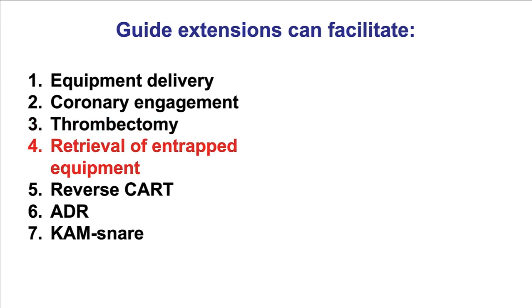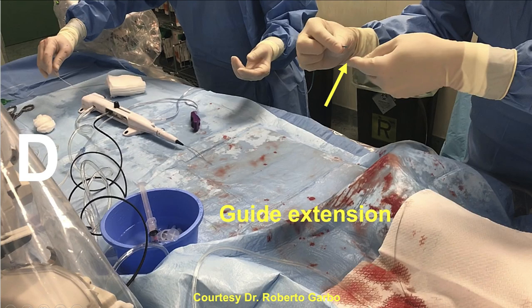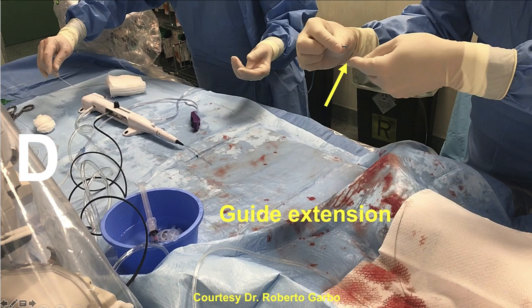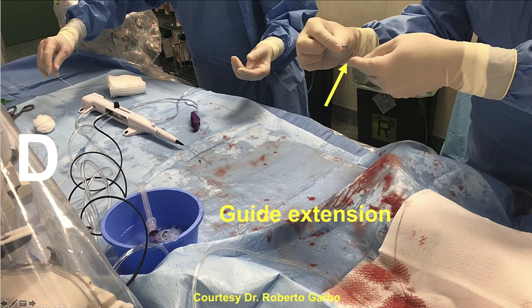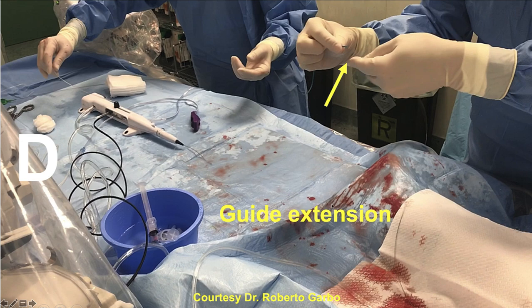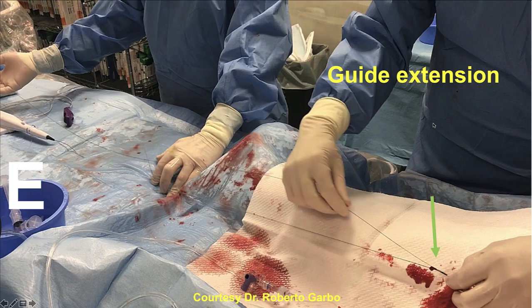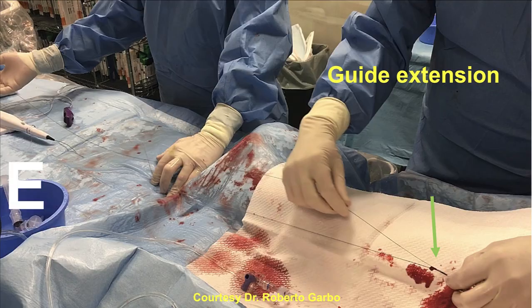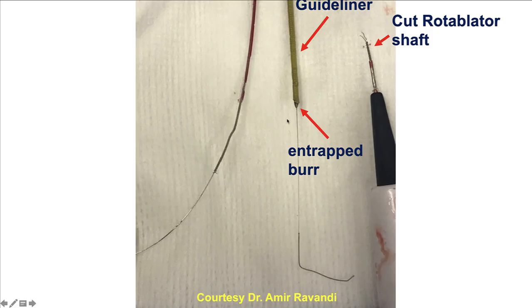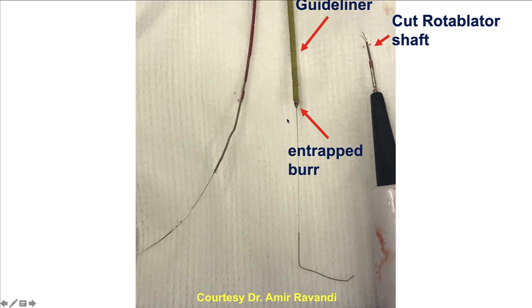The fourth one is for retrieving entrapped equipment. This is an example of a patient who had rotablator burr entrapment. The rotablator was cut, and then a guide extension was advanced over the shaft of the rotablator all the way to the area of entrapment. And after doing that, the rotablator burr could be successfully retrieved.